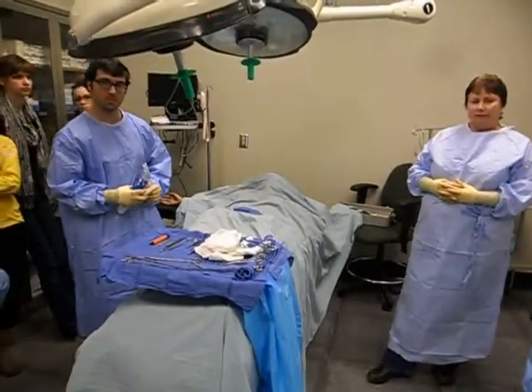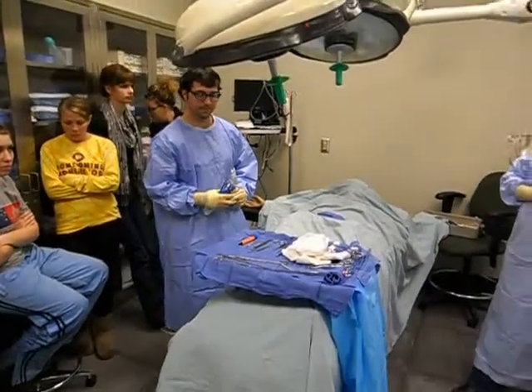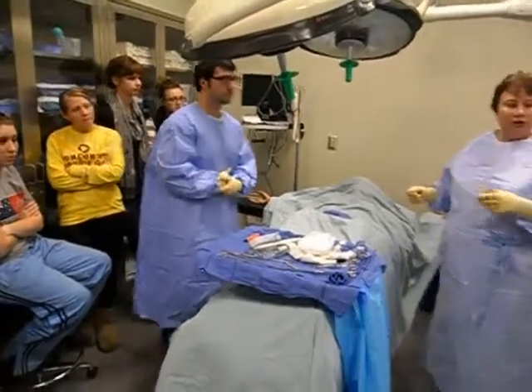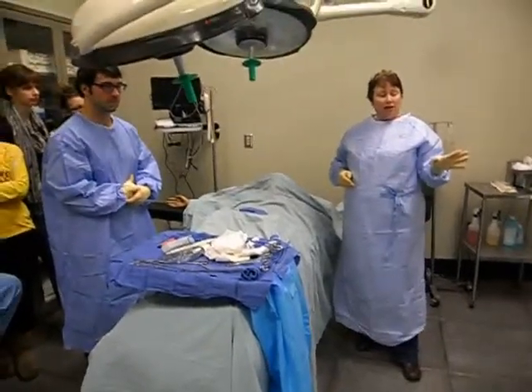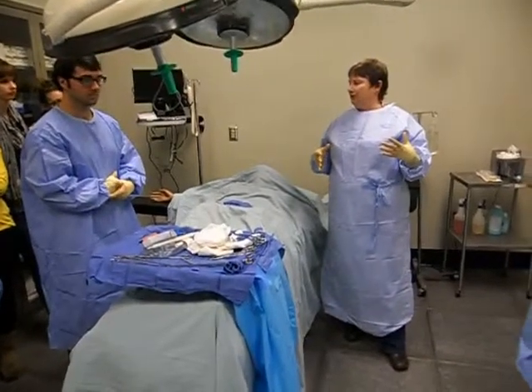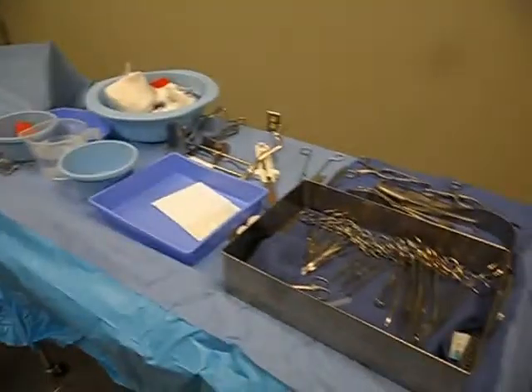He went over the bed with the drape. With the lap drape, he was really close to the bed, and then when he came up here with his towels, he was really close. Other than that, I thought your aseptic technique was good with your setup. I thought you were kind of organized, except for when I started throwing stuff at you, it threw your plan off.